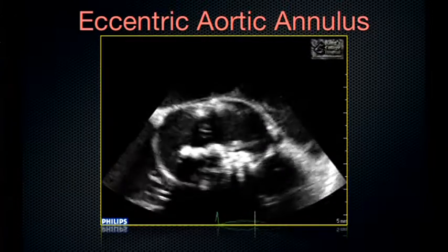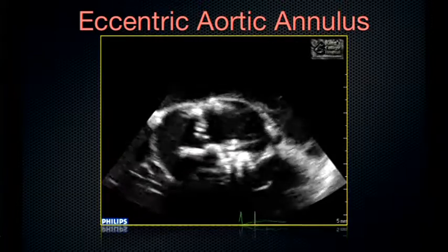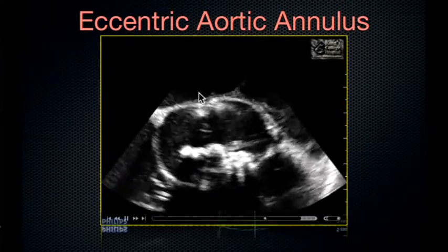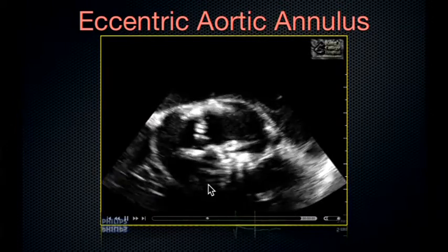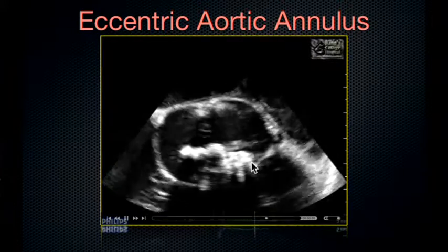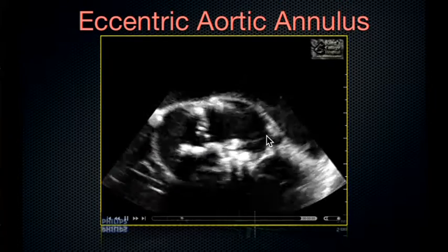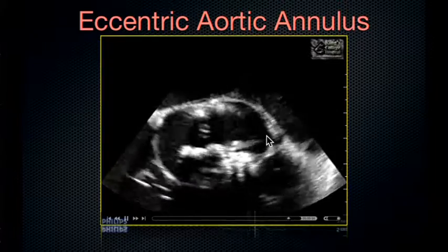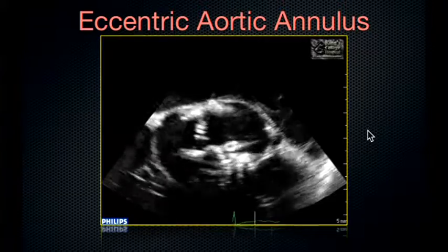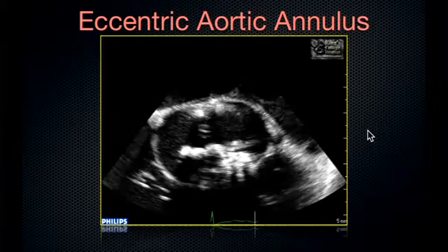Here's another patient. Based upon the transthoracic echocardiogram and an initial TE assessment, we thought they would be satisfactory for TAVI, because the AP dimension across here was 24mm. But as you can see, this appears to be a very, very eccentric aortic annulus. In fact, on this 2D echo it measured 34mm medially to laterally, which is clearly too large. But the advantage of having a 3D data set, of course, is we can make sure that this is not an artifact caused by an incorrect alignment of the transverse plane.